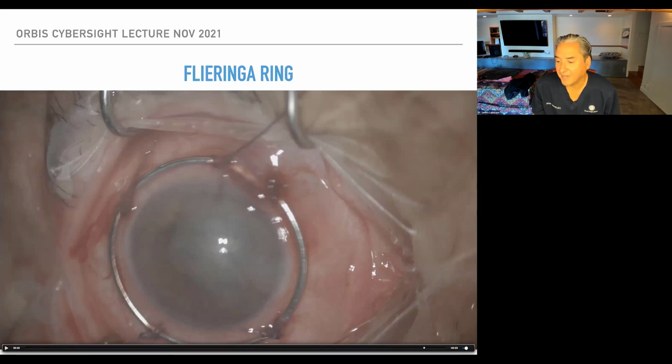And then Patrick Atta asked, for K-Pro, do you use a new cornea or the patient's cornea? I generally use a new cornea. It doesn't have to be a good one, meaning it can have poor endothelial cells. It can have haze. It can have a small optical zone. It can be from a 75-year-old, but yeah, I use a new cornea in those scenarios.